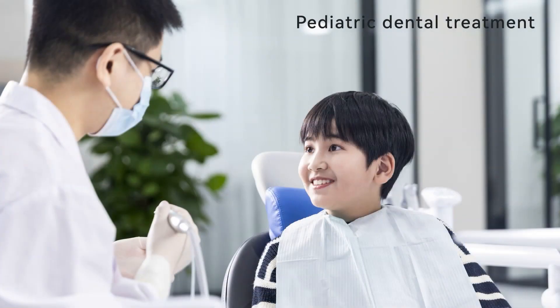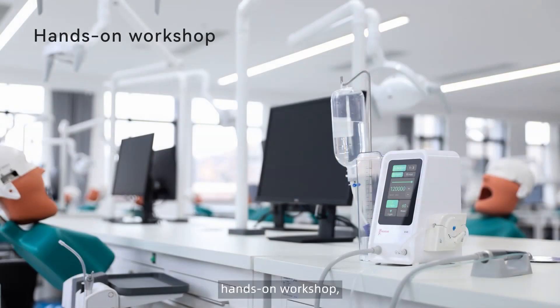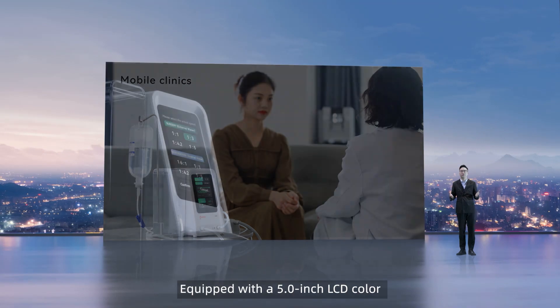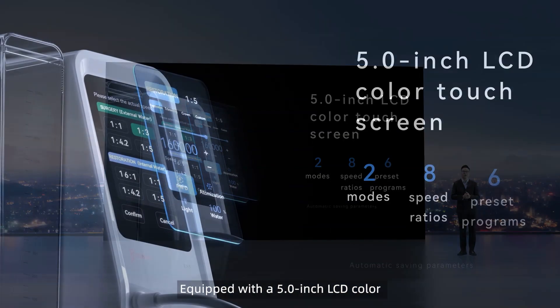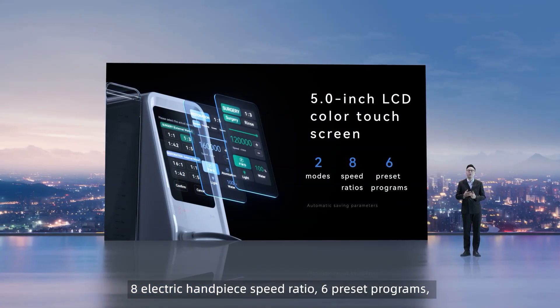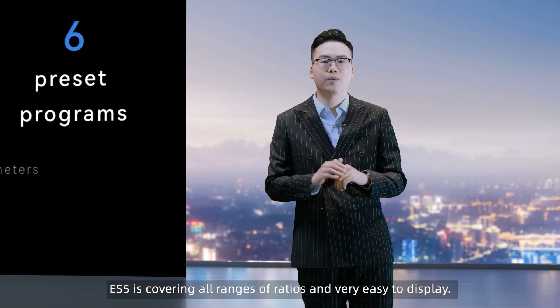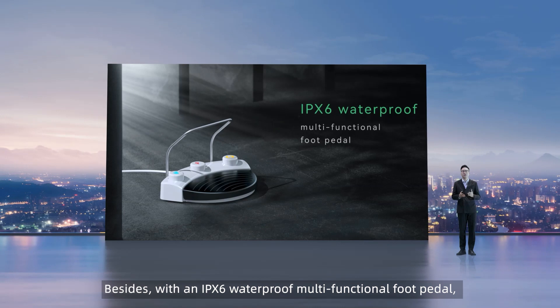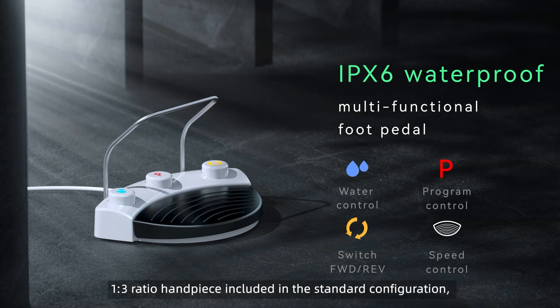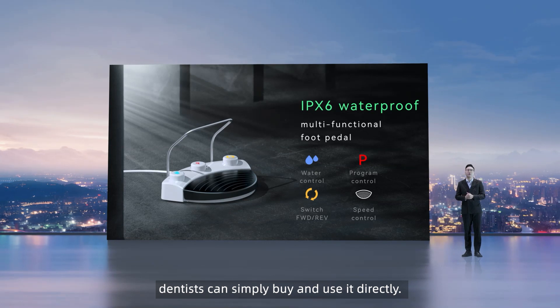Application scenarios include pediatric dental treatment, surgical operating rooms, hands-on workshops, and mobile clinics. Equipped with a 5-inch LCD colored touchscreen with simple design, 8 electric handpiece speed ratios, and 6 programs, ES5 covers all ranges of ratios and is very easy to use. Besides, with an IPX6 waterproof multifunctional foot pedal and a 1-to-3 ratio handpiece included in the standard configuration, dentists can simply buy and use it directly.